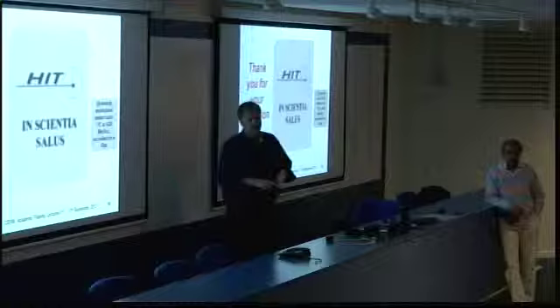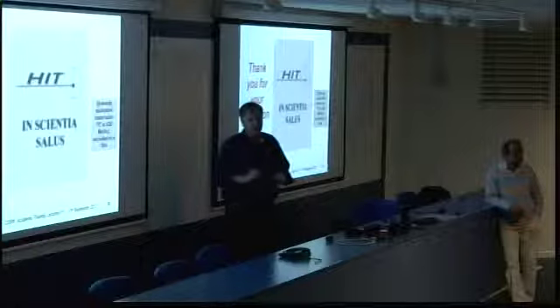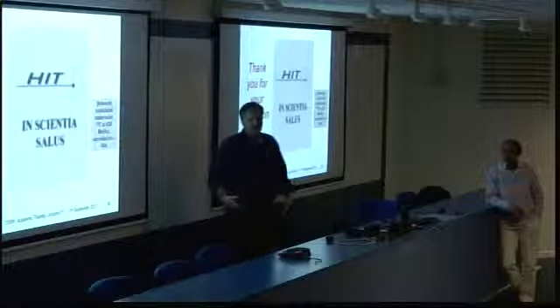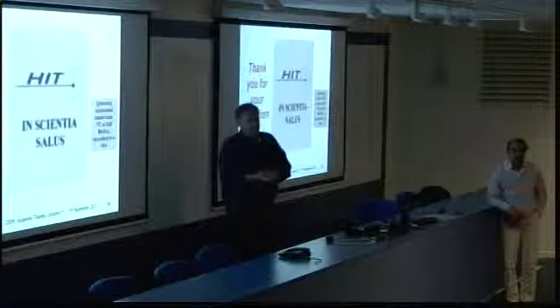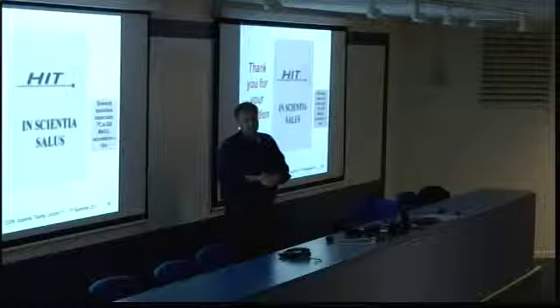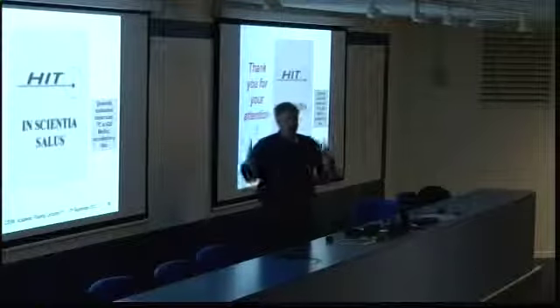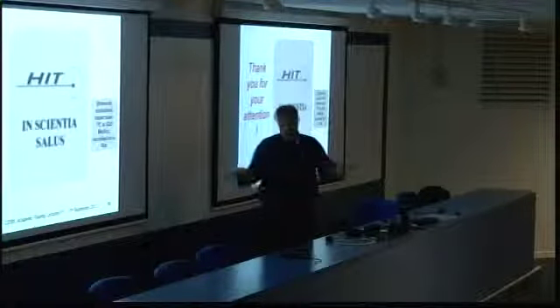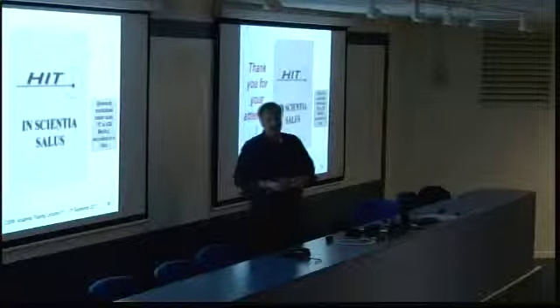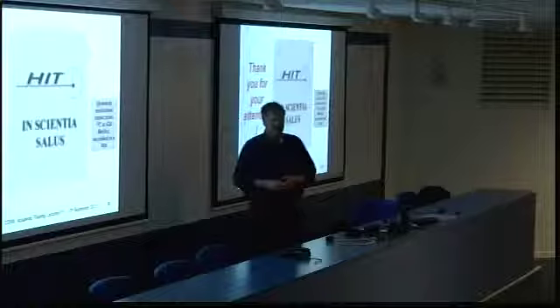This does not fulfill it, because you can rotate the patient only a little bit, let's say 5 to 10 degrees roughly. But also this is not easy. Everything which is weak in your body, to fix that and to have a position accuracy of, let's say, 0.5 millimeter, this is a story. It's not easy to do that. So the easiest way is to say the patient is in the middle. We position him always the same way, always horizontal, and then let the machine move around. So this is the thinking of the doctors, and I think from the customer view, this is not wrong.